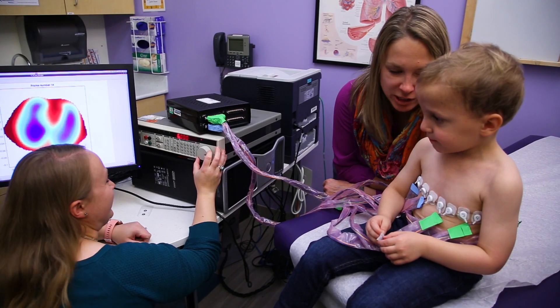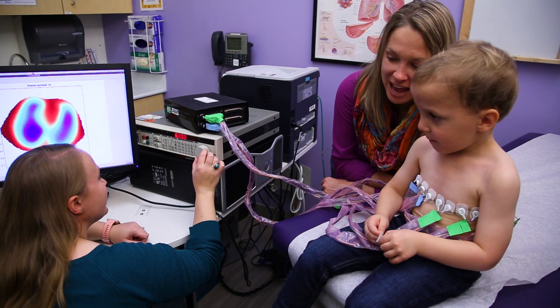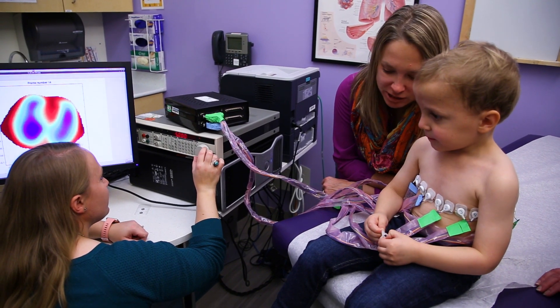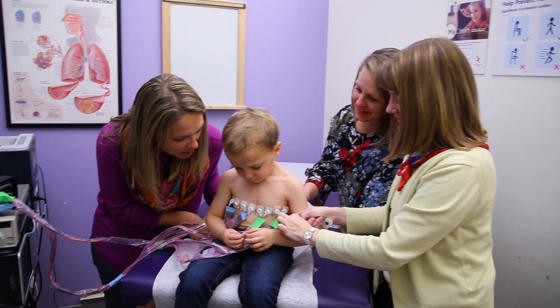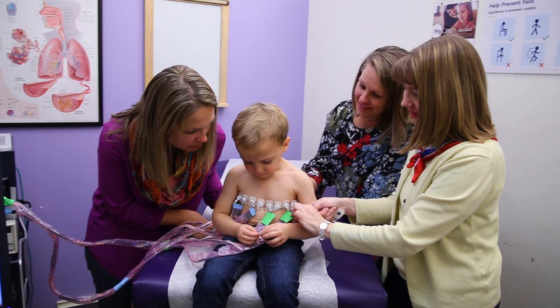EIT is Electrical Impedance Tomography, and it is a way to image the chest without radiation, without sedation, and in real time.